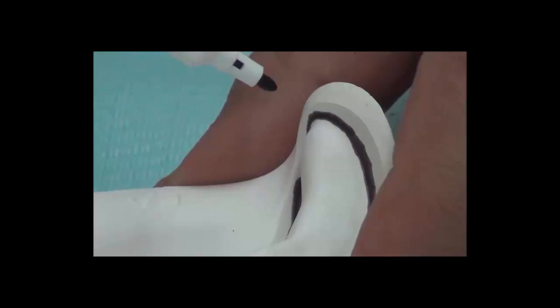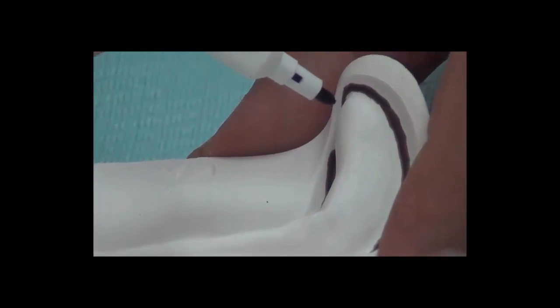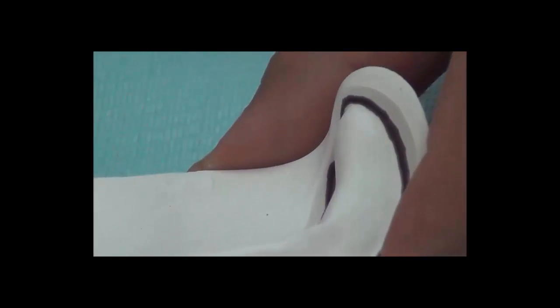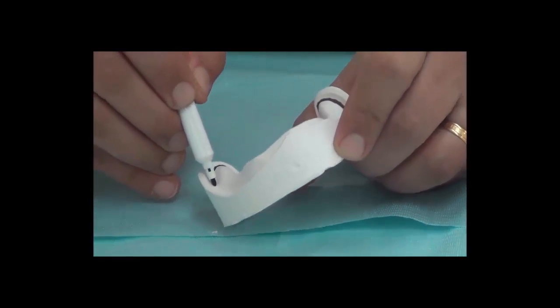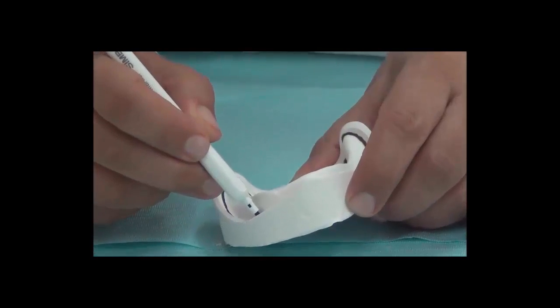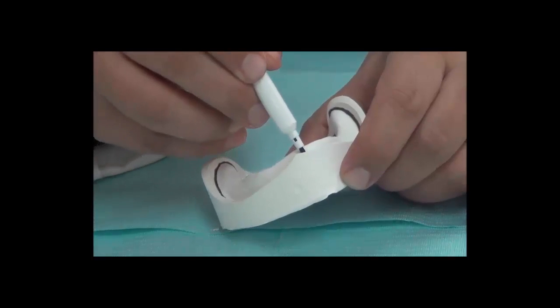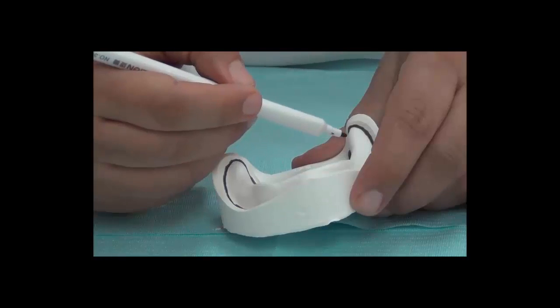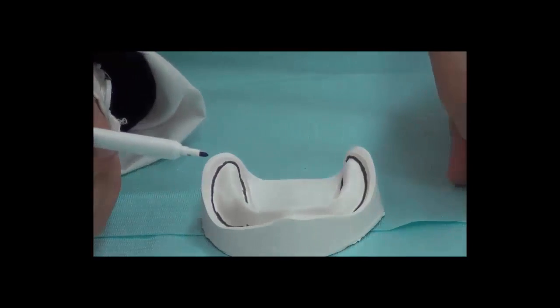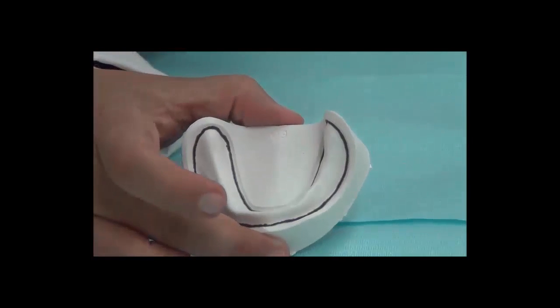In the impression, we include it all together. All the retromolar pad is in there. But in the denture, not all of the retromolar pad is included in the denture base. For impression purposes, we need to record the whole retromolar pad because we then want to select the areas we need to include inside the denture. So the impression is a bit longer and more distant than the denture borders in the posterior areas. So this is the outline of the sulcus.